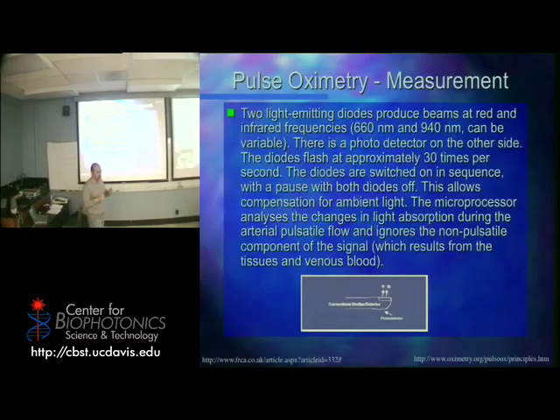You want to do this because if I've got that pulse oximeter and I'm out in the bright sunlight, guess what? Some light's getting in at those wavelengths and making it to the detector. Because you remember what happens when the light gets in and it scatters all over the place? Okay? It's getting to the detector. You want to be able to subtract that out.